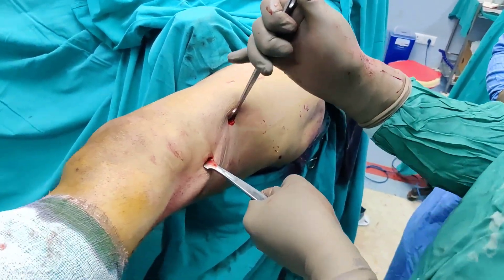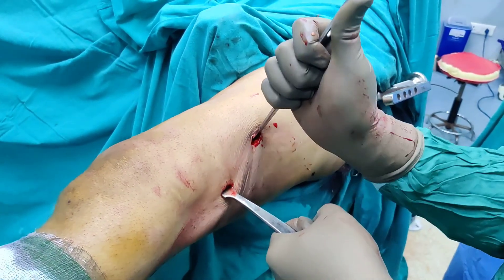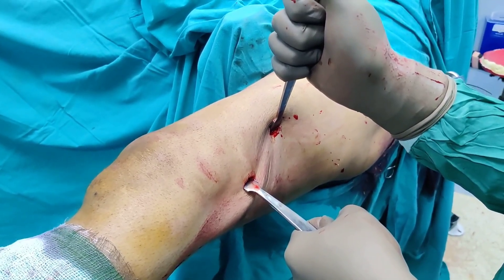We have inserted the Hohmann because the distal fragment is flexed. We have put one posteriorly and the other has gone anterior-medially so that we can translate the fragment. Let us see if we succeed.